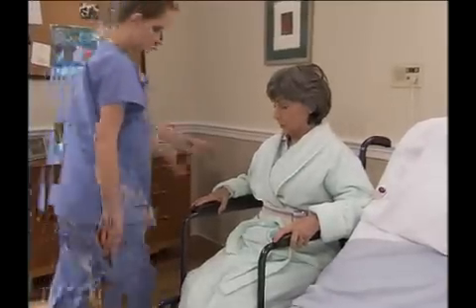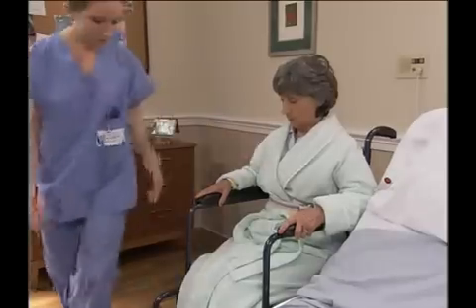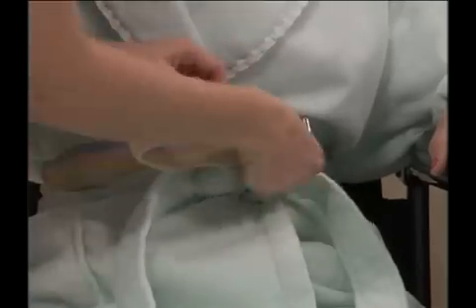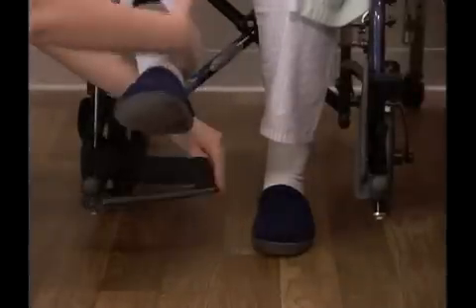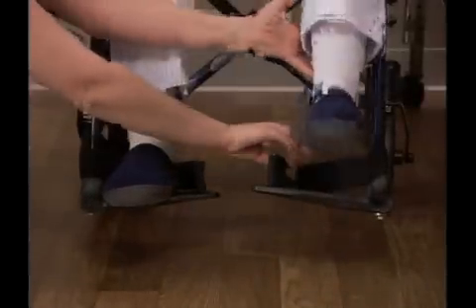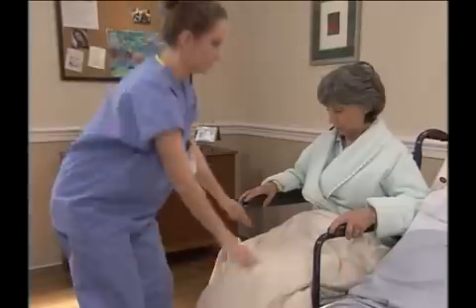Make sure the person's buttocks are at the back of the chair and that the person is comfortable and in good body alignment. Now, remove the transfer belt. Position the person's feet on the footrests of the wheelchair. Buckle the wheelchair safety belt if one was ordered. And cover the person's lap and legs with a lap blanket if desired. But make sure the lap blanket does not drag on the floor.